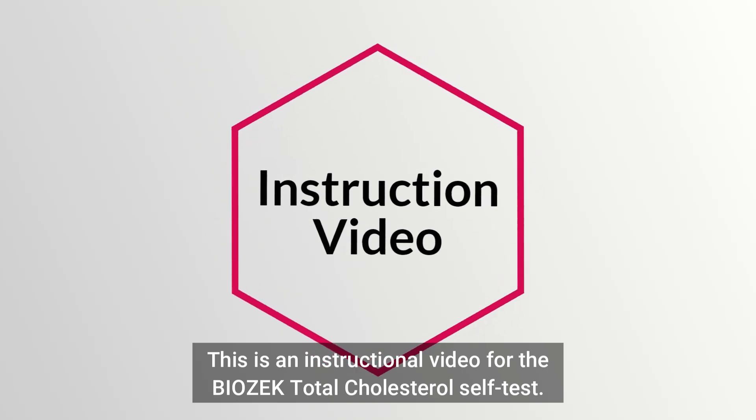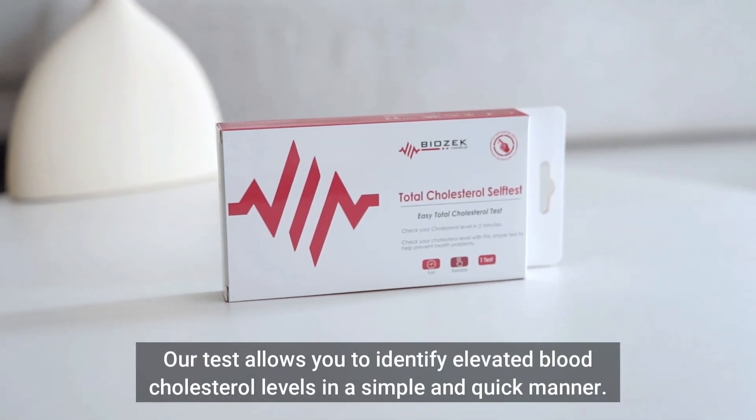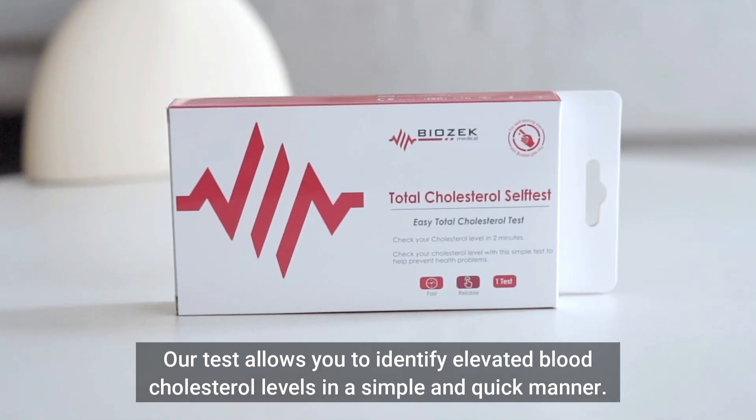This is an instructional video for the BioZec Total Cholesterol Self-Test. Our test allows you to identify elevated blood cholesterol levels in a simple and quick manner.